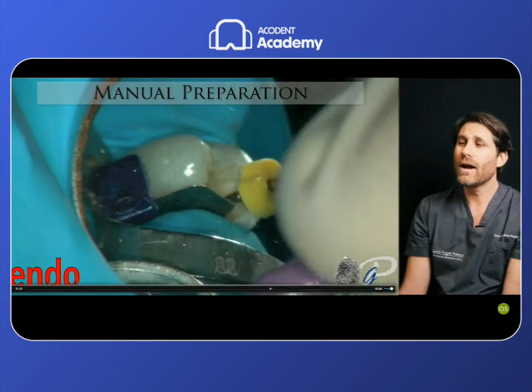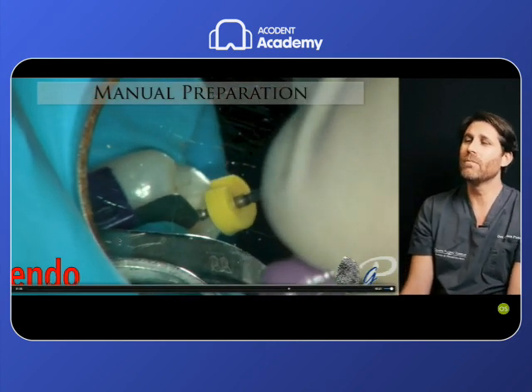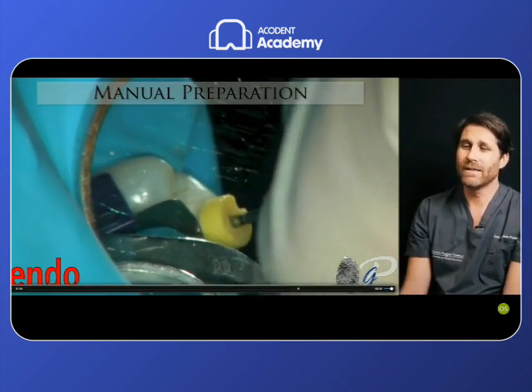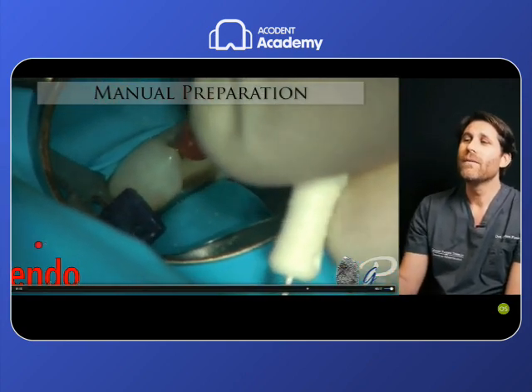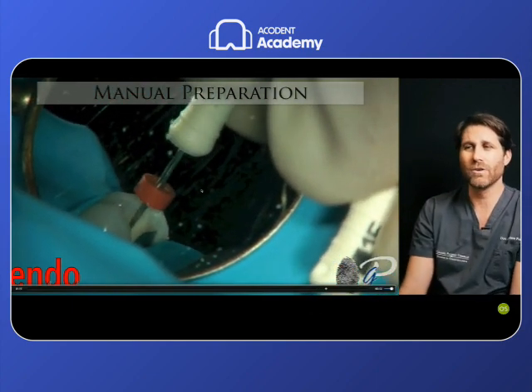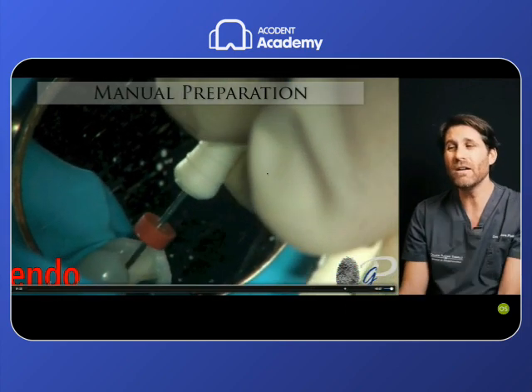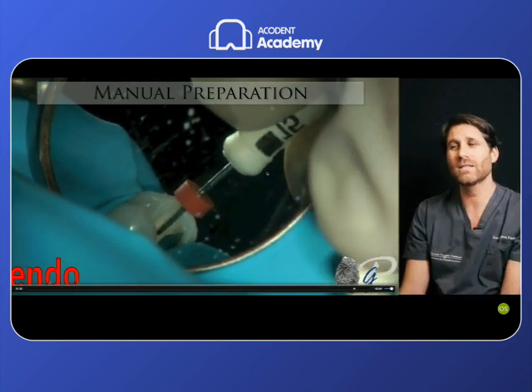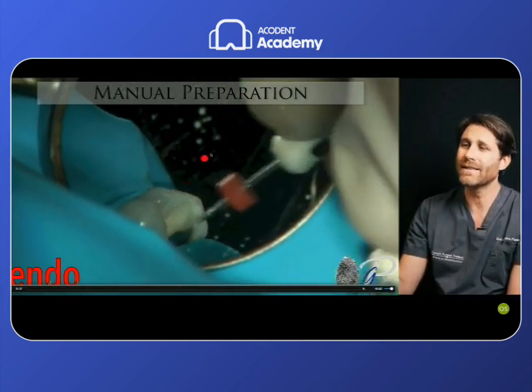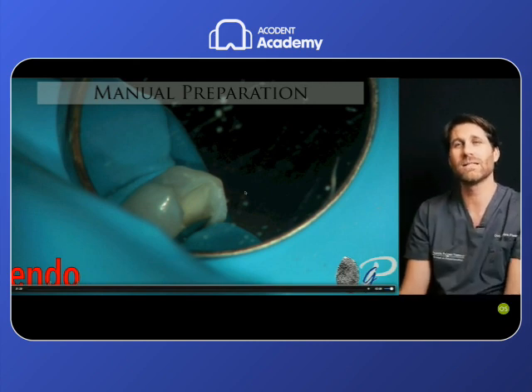Because we need to regularize the curvature and make this trajectory less difficult and easier to be followed by the stainless steel file. And we can do this only by deforming this trajectory, regularizing it, reducing the abruptness of the curvature. Sometimes we also need bigger stainless steel files. The 15 is very rigid, and it creates transportation very easily. So it's an instrument that I don't like to use so much for doing this. I really don't like to use instruments in stainless steel bigger than 10 because they are very rigid. They can make deformation and transformation of the apex.